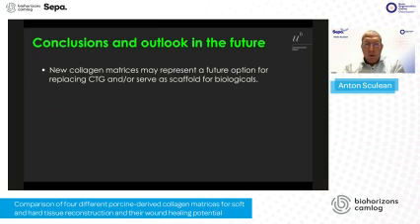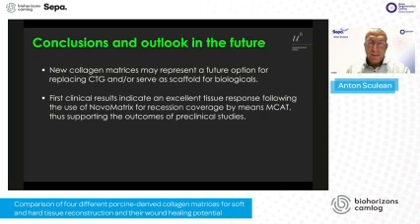So we may even combine autogenous tissue, a small portion, with a scaffold, with a collagen matrix. And I would like to emphasize again this expression of biofunctionalization, because I think that this may have clinical relevance for the future. First clinical results indicate an excellent tissue response following the use of NovoMatrix.